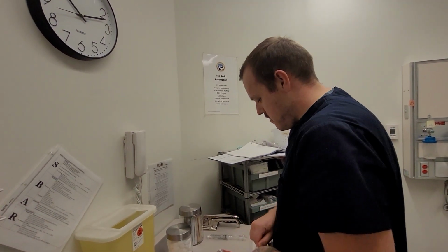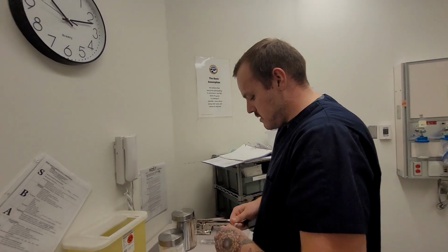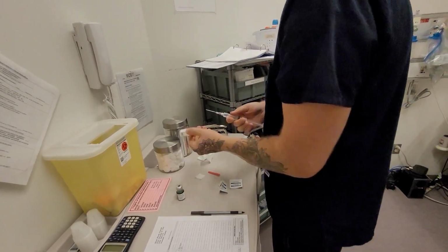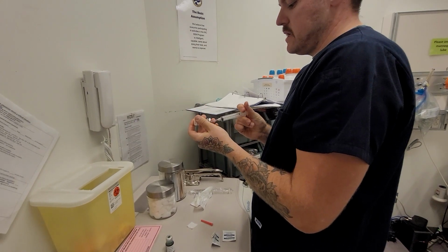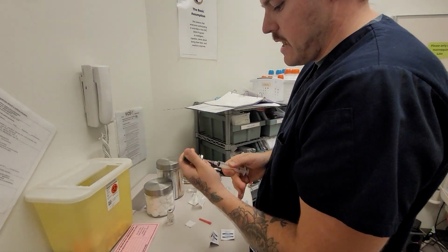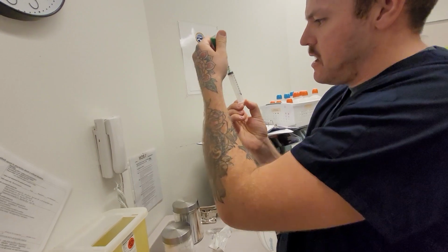So we can get this ready here. We're going to put 9 mils of air into our normal saline here, so that makes it easy to pull out. 9 goes in. Now we can go ahead and take 1 mil out of the medication.